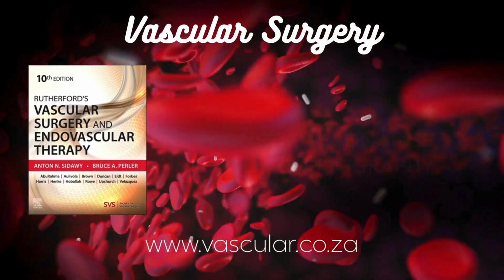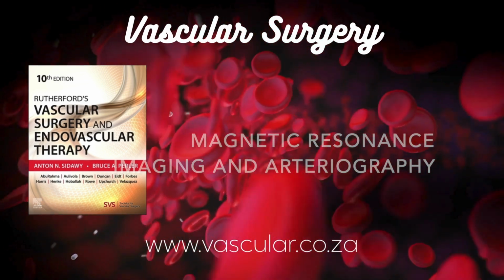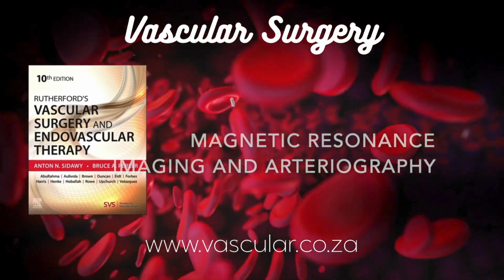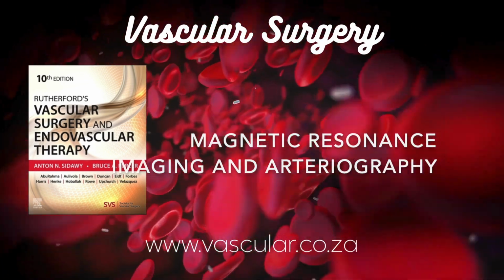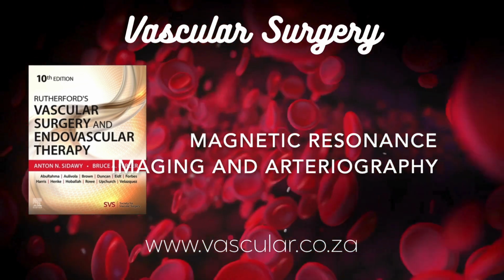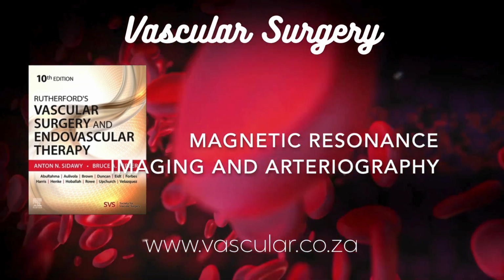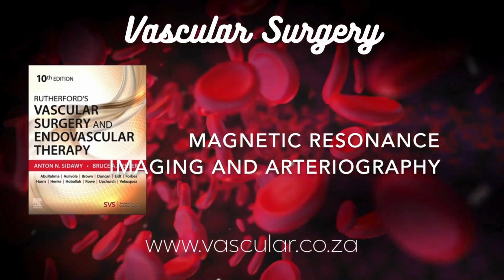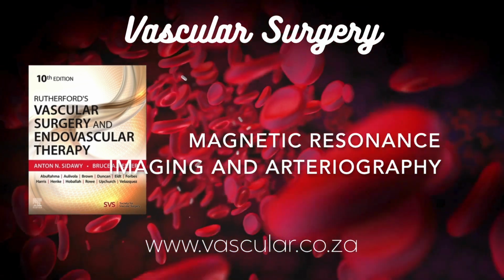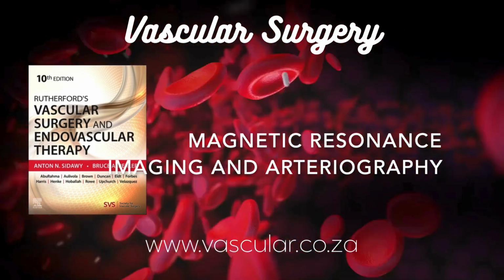ASL, arterial spin labeling, actually uses magnetically tagged blood water itself as an internal tracer to map blood flow or perfusion. Wow. Others, like FBI, FSD, QISS, they all have specific advantages and disadvantages, maybe related to flow speed or sensitivity to magnetic field uniformity. But honestly, in day-to-day practice, TOF and contrast-enhanced MRA are still the most commonly used workhorses. QISS, for instance, can be really fast for speedy flow, but needs a very stable magnetic field.